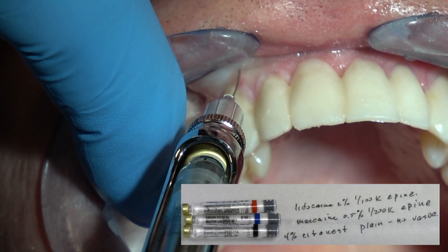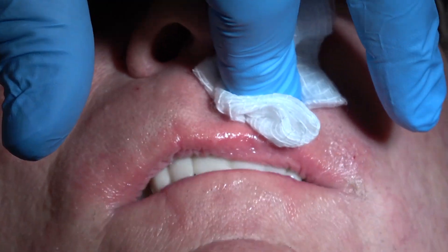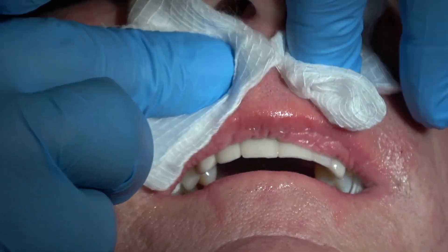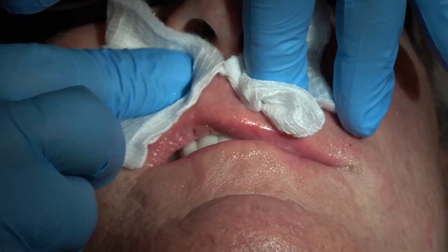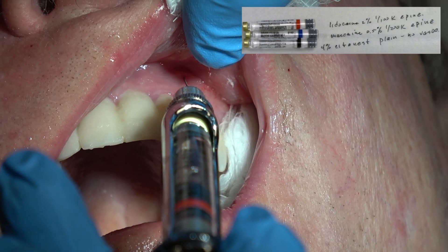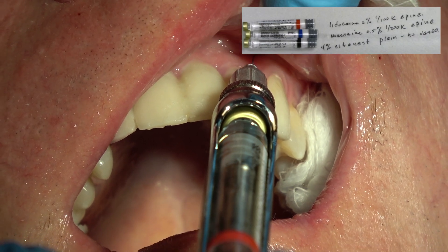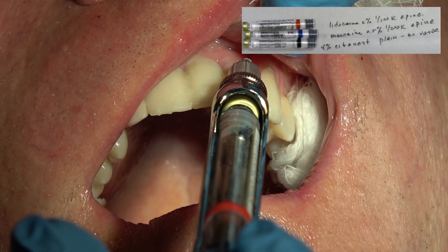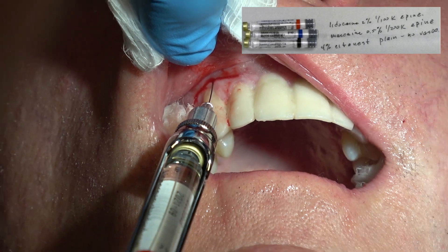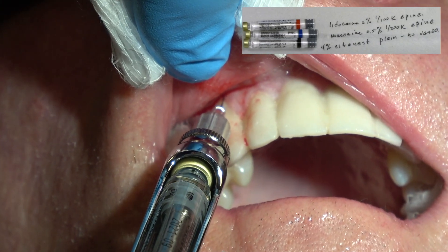Just barely pierce that tissue, tap the end of the syringe, and then you can go further into the tissue. That's the Citanest 4% plain, no vasoconstrictor. I'm going to rub and massage that in. Then I'm going to come back with lidocaine. Now the tissue is numb, so they're not going to feel anything. Lidocaine 2%, 1 to 100,000 epinephrine is a more profound local anesthetic, and I can use that once the tissue is painlessly numbed with the Citanest 4% plain.